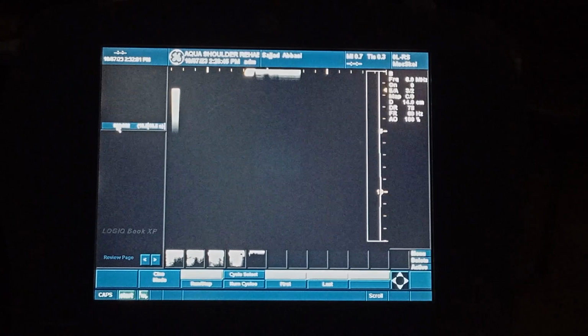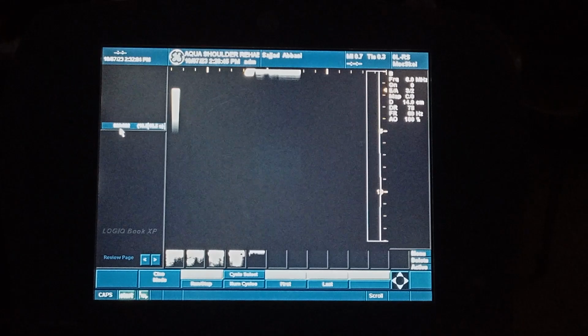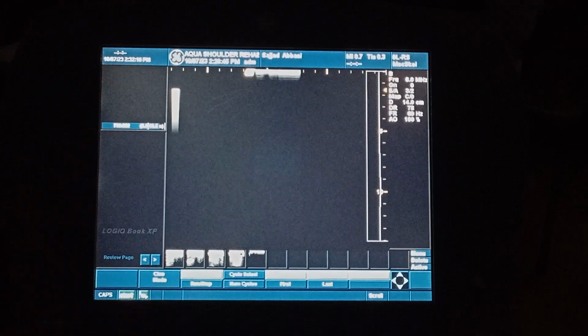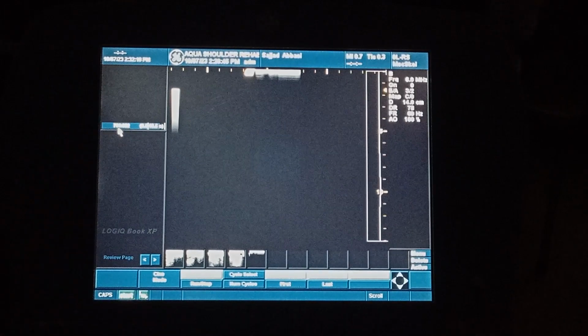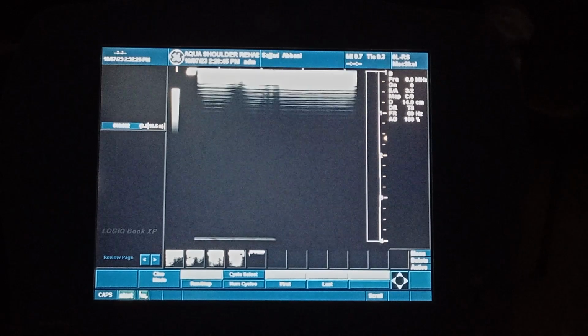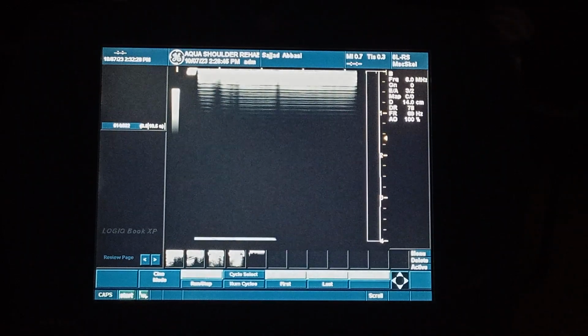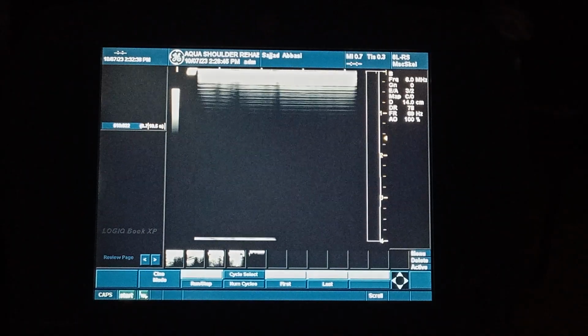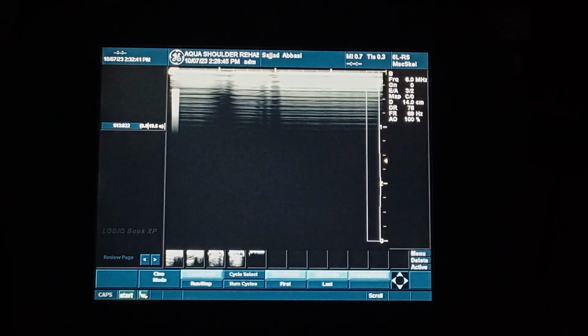Over here, this line shows you the total time, 10.5 seconds, and within the 10.5 seconds you can see 822 images, and you can scroll through them. You can see this number changing from 822 to 760, and you can see the screen also changing. So you are going back in time, just like looking back in time. Here you can see very easily that at that particular time we were at this level, then this level, so we changed the depth. That's how it works.